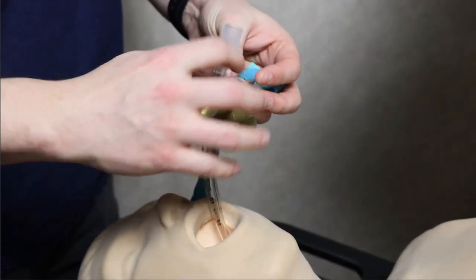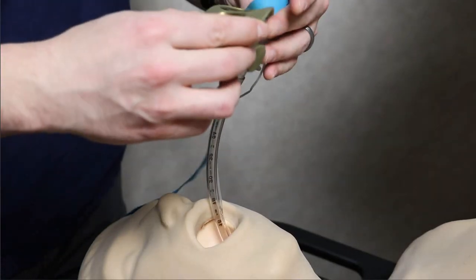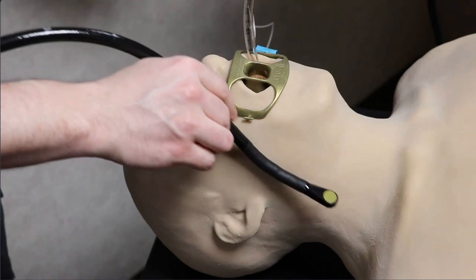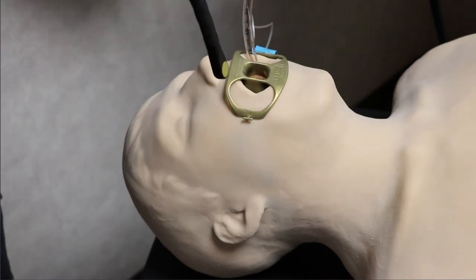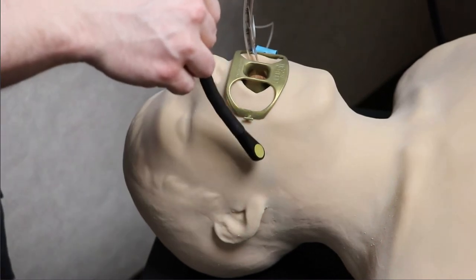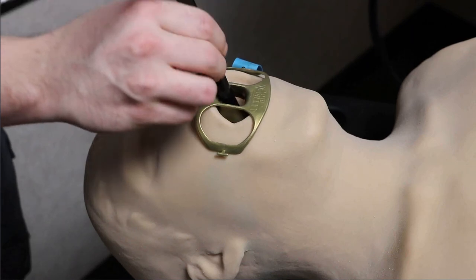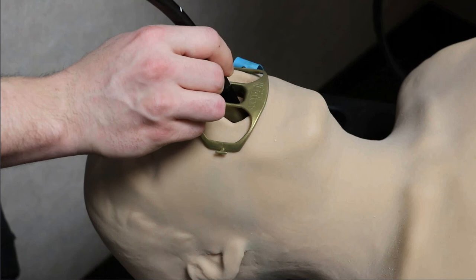Here's putting on the mouth guard — notice the ET tube goes through one of the lateral ports on the side closest to the ventilator, and you have a central hole for placing the transesophageal echo probe through and intubating. You're going to insert the probe in through that central hole, get to the back of the mouth, antiflex just a little bit by rotating the top knob, and then slowly advance into the esophagus. There shouldn't be a lot of resistance — if there is, there might be a problem with the intubation and you should rethink and try again. Then advance all the way to where you can see the mid-esophageal images.